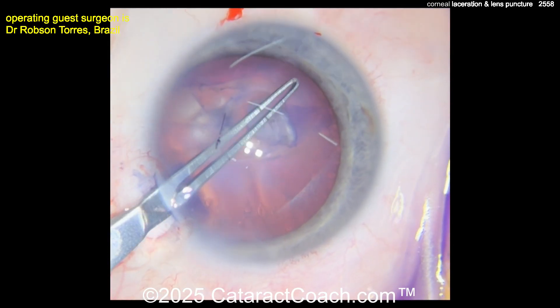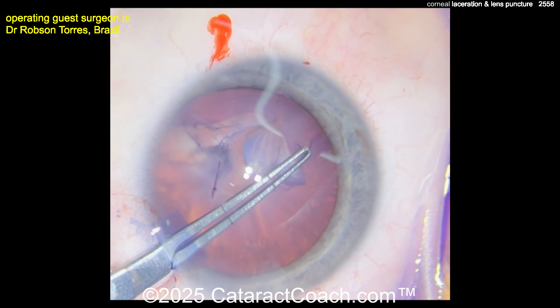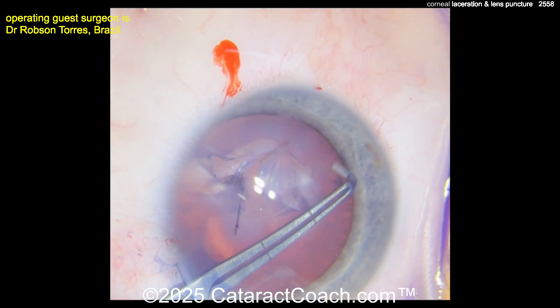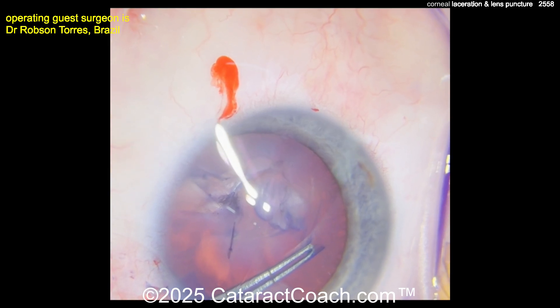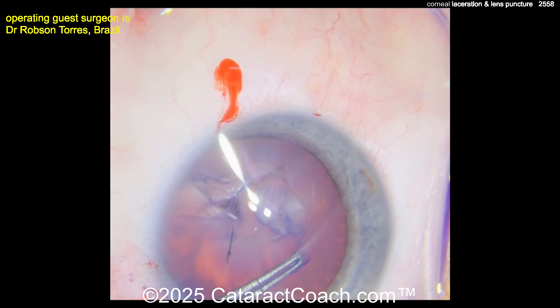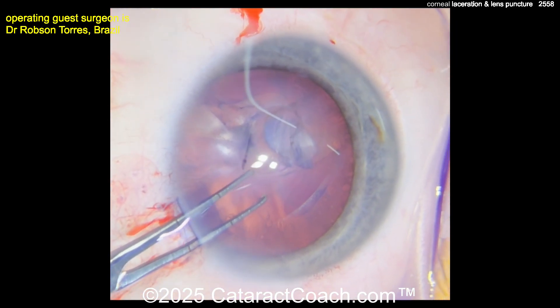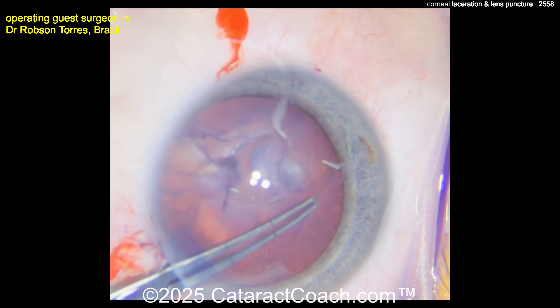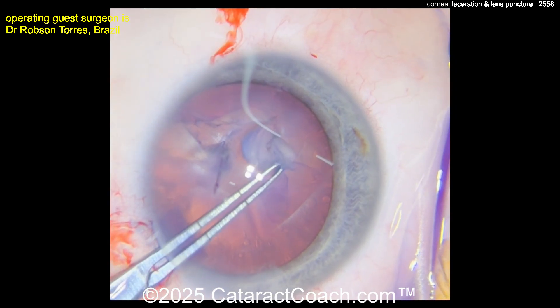How are you going to fix this? We're going to start making a capsulorhexis, so you can poke in here on the capsule and try to bring it around. But you have an area that's already been radialized out, so you're going to have to be very cautious. This is a very soft lens. I like how the surgeon is taking time to make a beautiful rhexis here. You have an irregular tear out to the periphery that won't be fully addressed just by doing a beautiful rhexis.